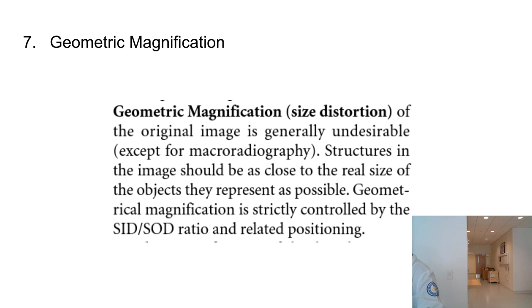Probably not noticeable. But if you are going to have OID, again, you want to annotate your image because the radiologist doesn't know that in order for you to get your cassette close up to the patient, you had to put a sponge in some direction to make it work. All they see, and you're not used to this, is images. It doesn't occur that often, maybe in fluoro. Outside of that, they don't see the patient very often.